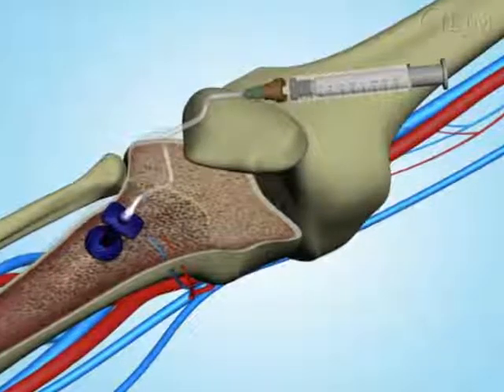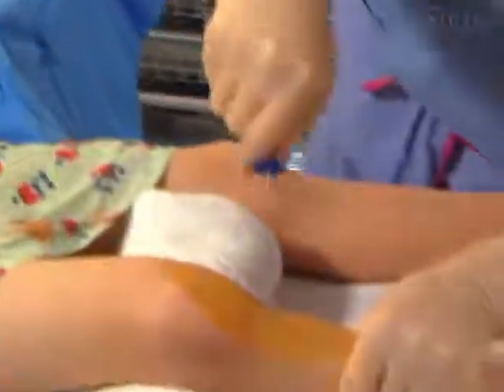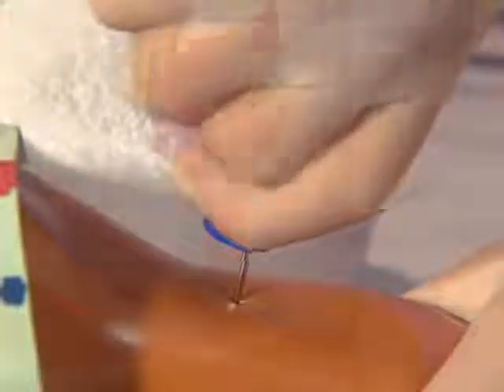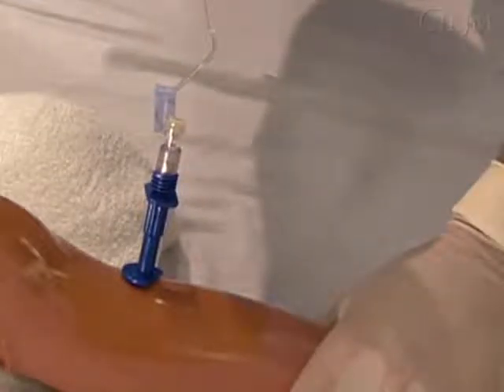Appropriate placement of an intraosseous catheter is a reliable means of obtaining urgent vascular access in children with low rates of reported complications. Both manual and power-assisted placement techniques can be used to deliver fluids and medications rapidly during pediatric resuscitation.